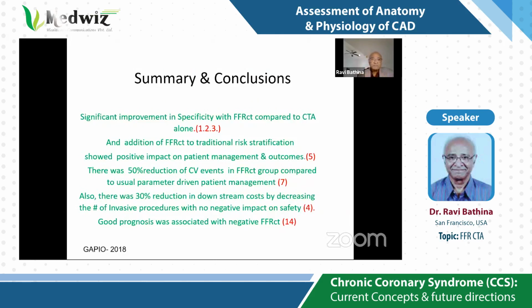What we noted is there is significant improvement in specificity with FFR CT compared to CTA alone. And addition of FFR CT to traditional risk factor stratification showed positive impact on patient management and outcomes. There was 50% reduction in cardiovascular events in the FFR CT group compared to the usual parameter-driven patient management.